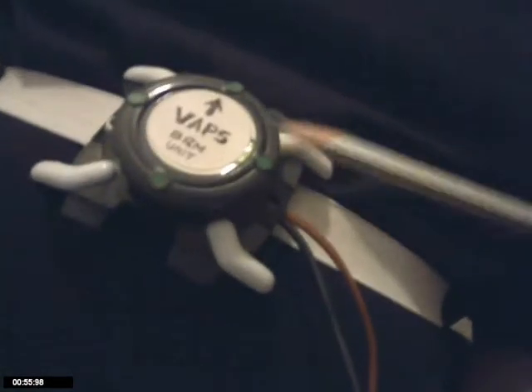This is the breath rate monitoring unit. It's strapped on to a person sitting on a chair. And you can see the black and orange leads that are coming out. One supplies voltage and the other carries the breath rate signal. We've got a very sensitive accelerometer inside this enclosure that picks up the chest movements.